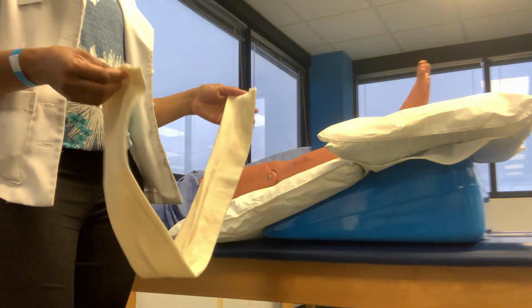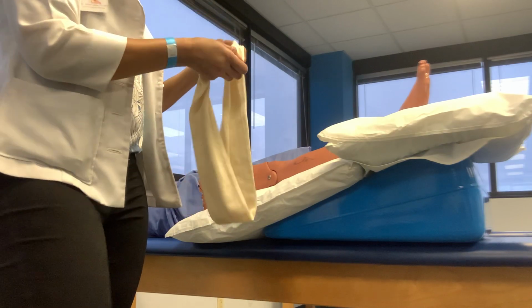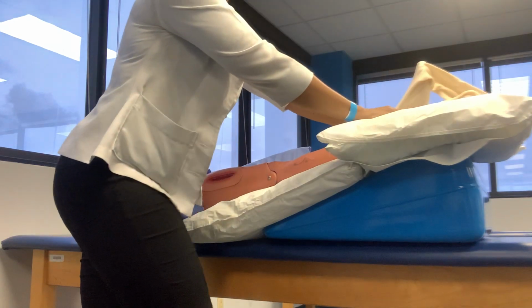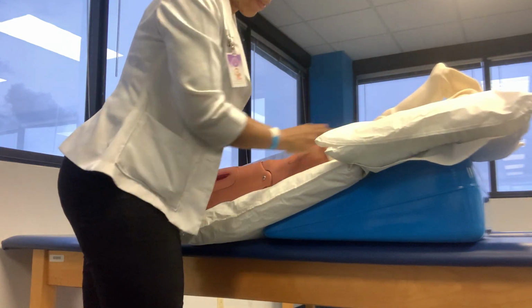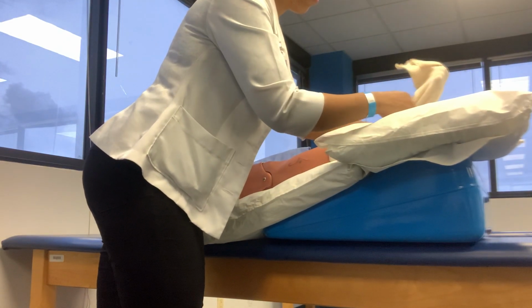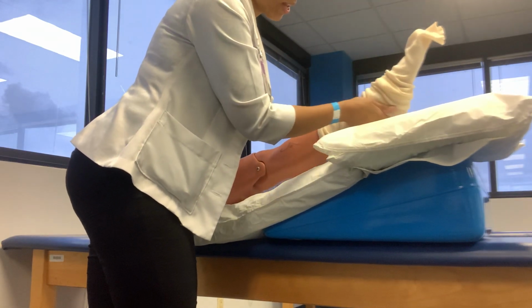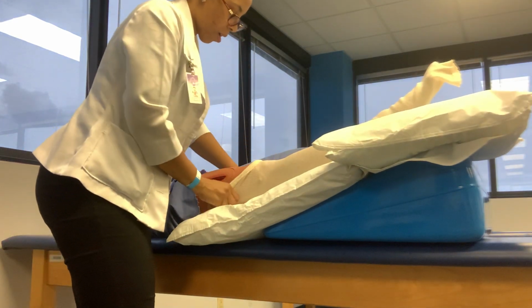So everyone is going to measure their own length of stockinette for themselves. And I'm going to place it on the patient's foot. So you want to make sure that you're not having to pull too much. So you want to roll down the stockinette. And when you're cutting your stockinette, the longer the better. And I'll show you why.